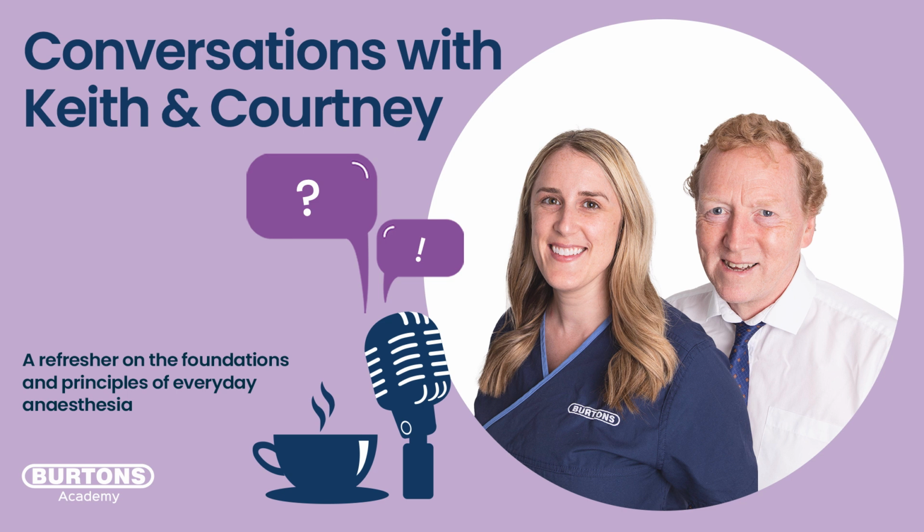At the moment, we're expecting it to be nearer the 90 to 100%. But in a circle, that wouldn't be the case for all sorts of reasons. And just as you described, it wouldn't necessarily be the case on a non-rebreathing system if the oxygen cylinders run down or there's some other gas being introduced. So absolutely right. And they are cheap now.